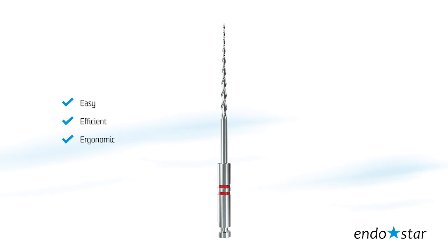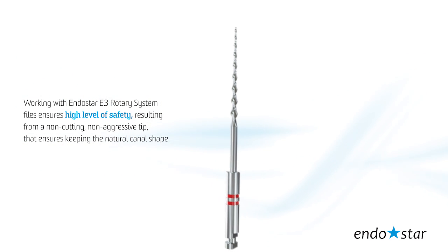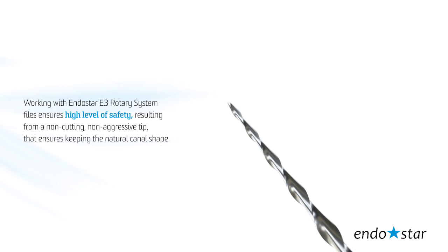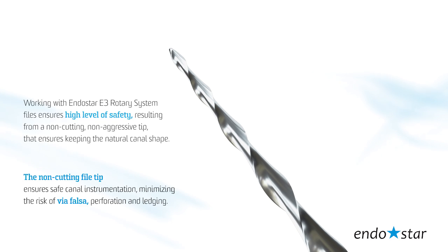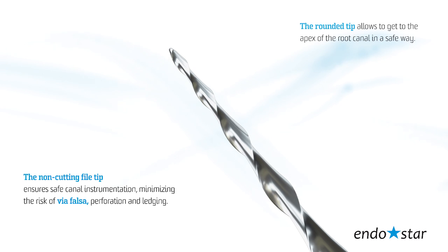Easily identifiable taper and ISO sizes streamline your work. Working with the EndoStar E3 Rotary System files ensures a high level of safety due to a non-cutting, non-aggressive tip that ensures keeping the natural canal shape. The non-cutting file tip ensures safe canal instrumentation, minimizing the risk of via falsa, perforation and ledging.